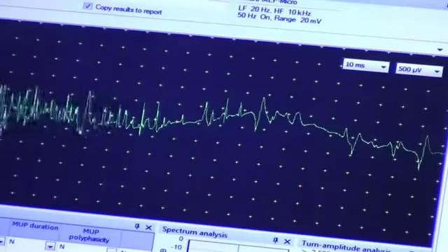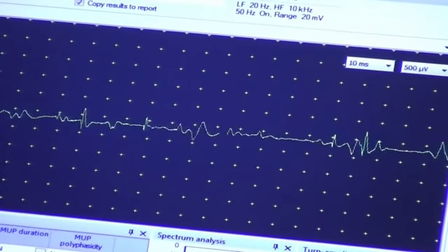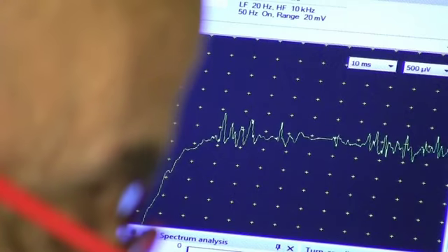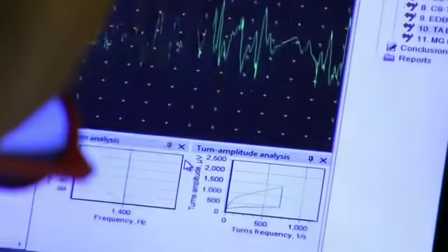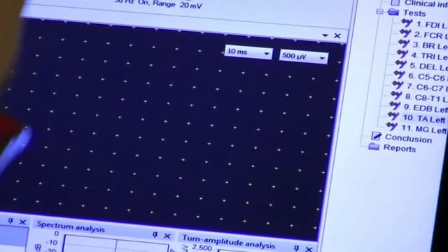Now I'm going to ask her to point your toes towards your nose. And again, I see the motor units, and I can study them, and they look okay. Now point your toes even further up, all the way. Here we go. And she's filling the screen. So that's full activation. Now relax. And that was the tibialis anterior muscle.